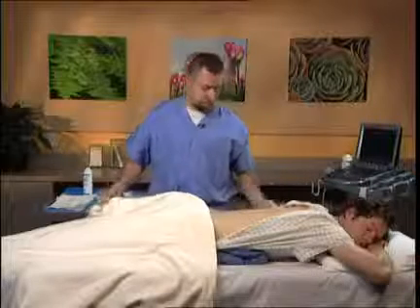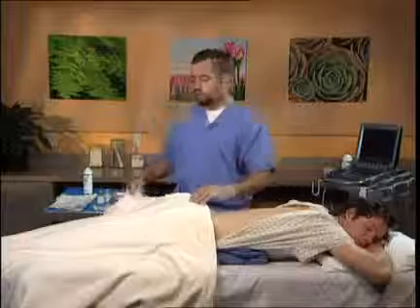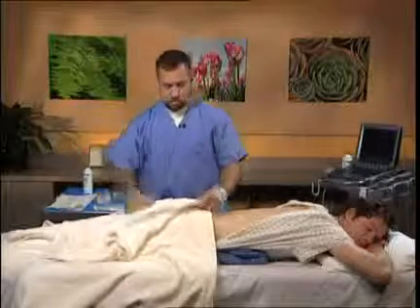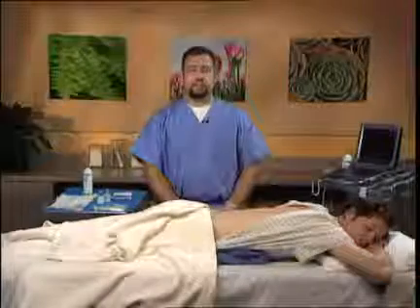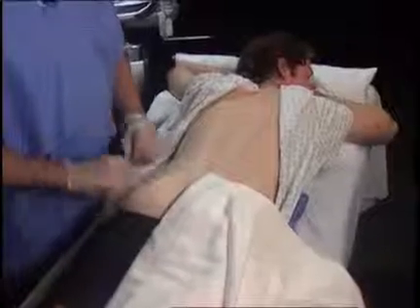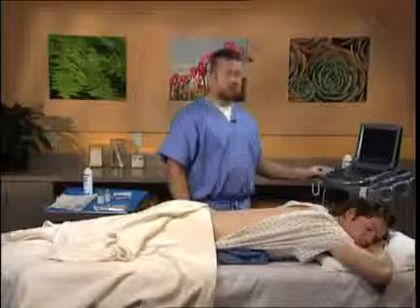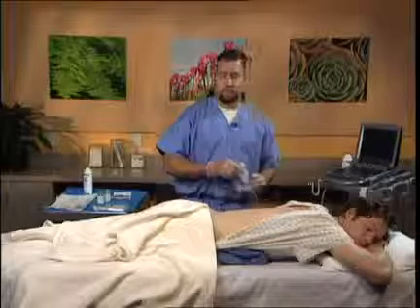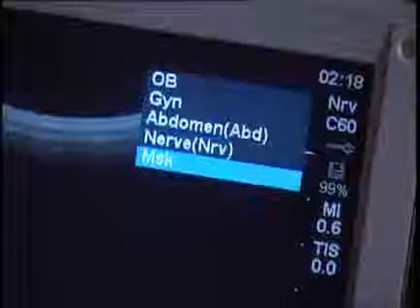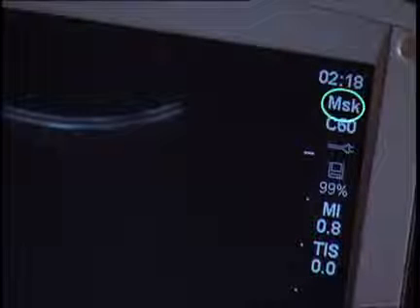The patient is placed in the prone position with a pillow underneath to provide a bolster. The side in question is identified and prepped. The gluteus is exposed. For facilitation of visualization, I utilize the Sonocyte M Turbo with the musculoskeletal setting to help enhance the muscular fibers of the piriformis muscle, the gluteus minimus and maximus, and the curvilinear probe facilitates entry of the needle into the targeted site. To perform this particular block, the following equipment is necessary.